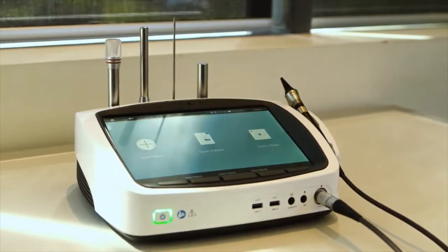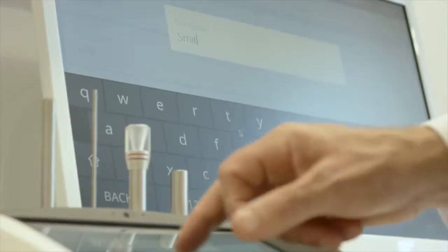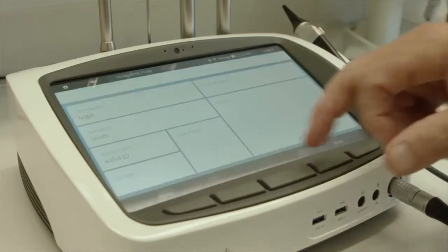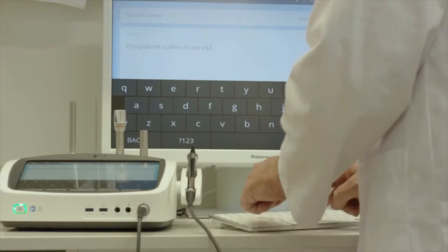Introducing the Pro-EX Telehealth Hub from VisionFlex. Simplify your patient examinations and streamline your workflow with the Pro-EX, the latest technology in high definition multifunctional medical imaging.